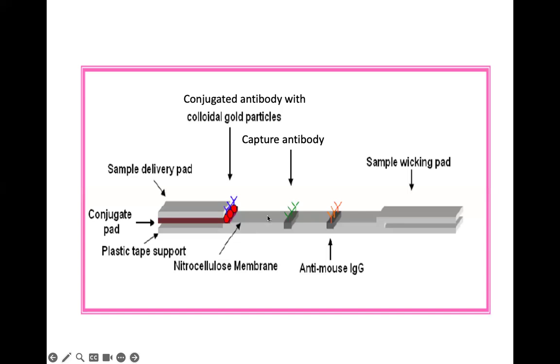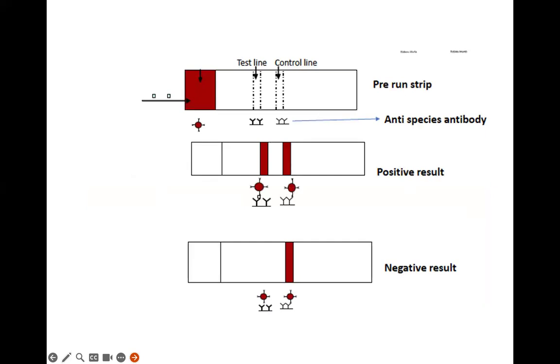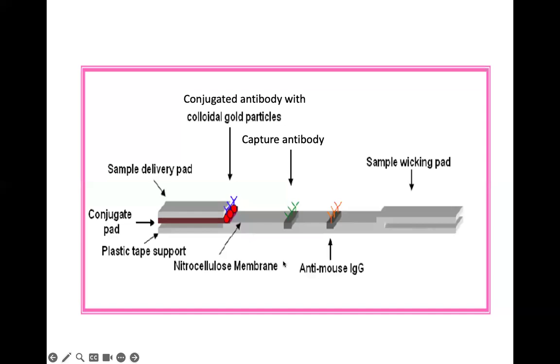There are many types of pads, what we call all these pads. They can be assembled, okay? And this padding is based on nitrocellulose membrane. And there are other types of membrane that can be used. And even this nitrocellulose membrane also has different pore size.